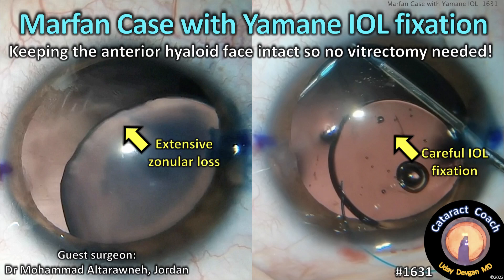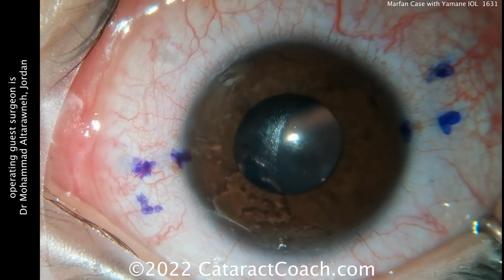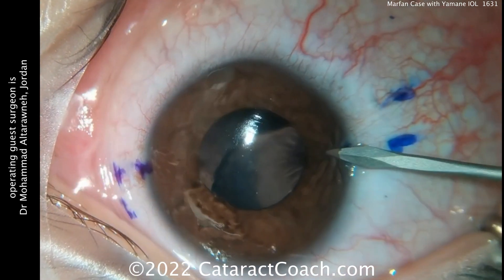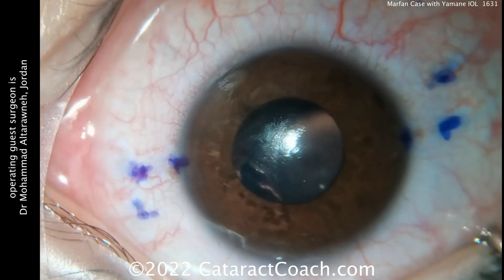CataractCoach.com — a Marfan case with Yamane intrascleral fixation. What's unusual is because the patient is so young, you're able to keep the anterior hyaloid face intact. Our operating guest surgeon here has a patient with Marfan syndrome, and you can see the sclera has been marked off in preparation for the Yamane.